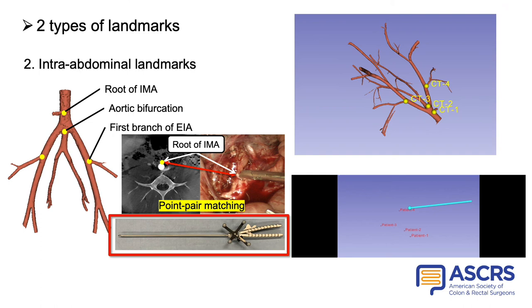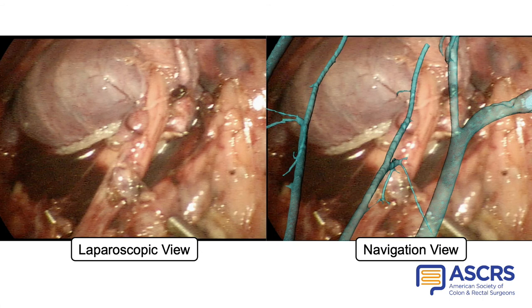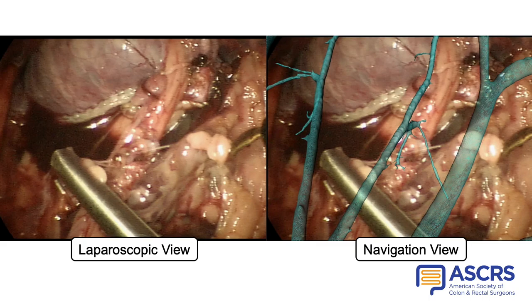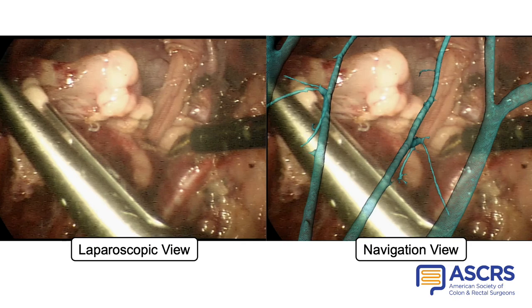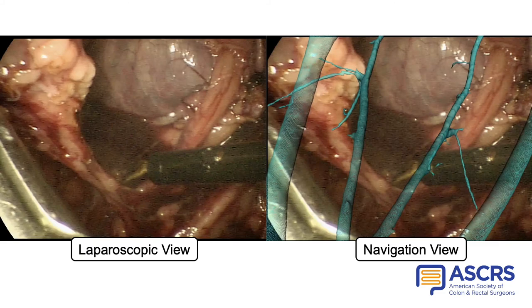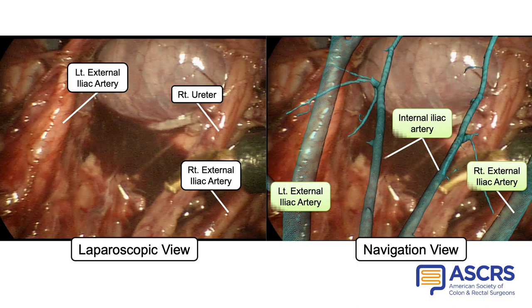These points were used to achieve registration. This shows the images provided by laparoscopy and the navigation monitor. Integrating the positional information from the preoperative images with the surgical field makes it possible to synchronize the laparoscopic viewpoint with the CT images. Tracking the position of the scope enables augmented reality-based navigation in which a 3D vascular model constructed from preoperative CT is superimposed onto the laparoscopic images. In the laparoscopic view, blood vessels are buried under the tissue and cannot be seen, but in the navigation view the 3D artery model is overlaid onto the laparoscopic view, allowing this anatomical information to guide surgery.